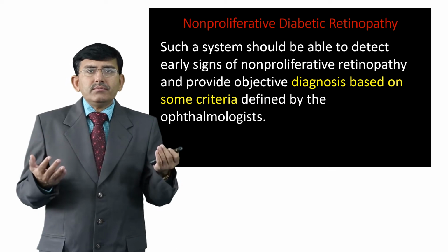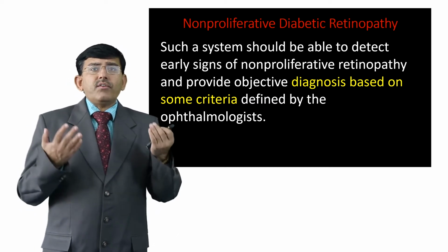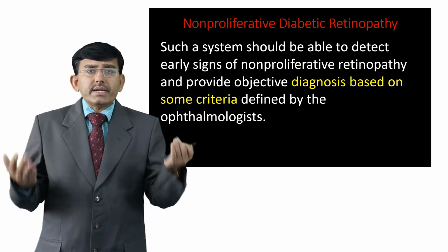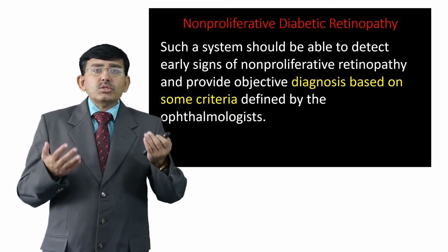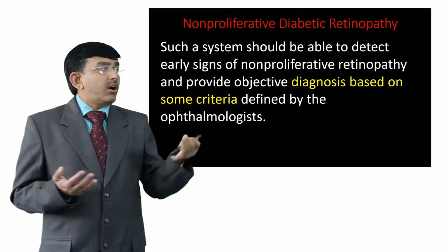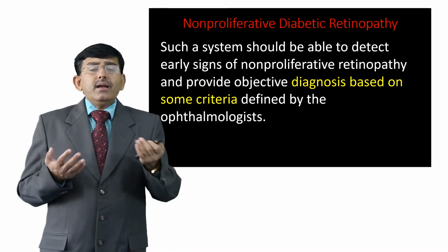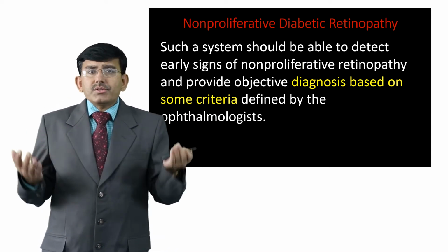Such a system should be able to detect early signs of non-proliferative retinopathy, and it should also provide objective diagnosis based on a certain predefined set of criteria by the ophthalmologist.